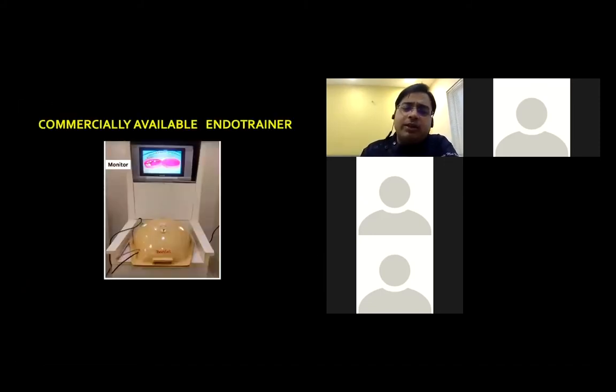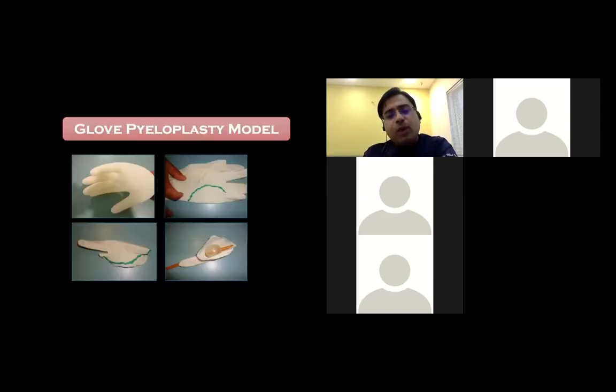This is the commercially available endo trainer. We all know it is a costly affair, about 10 to 12,000, and requires a separate television. But if your institute can afford it, then it is also a very, very effective tool to have. Now I will talk about various models that can help you practice various exercises. We all know about bead models, glove transfers, and various exercises that can be done in the dry lab.